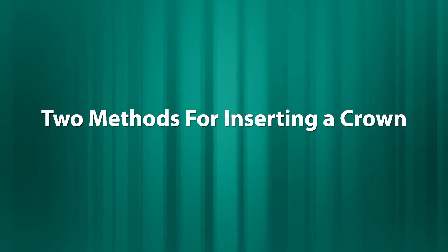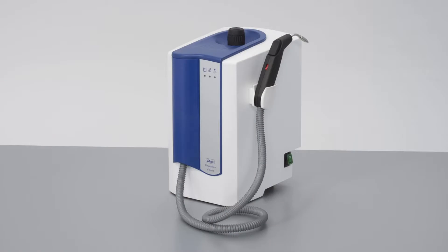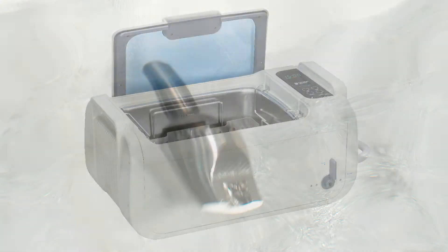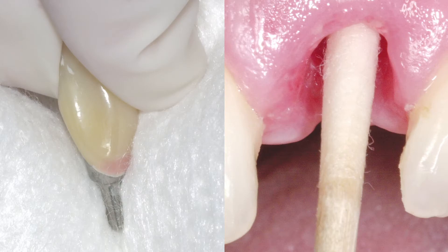There are two methods for inserting and seeding a crown. But prior to discussing these methods, we should always make sure the implant well is clean and free of any particles. Also, if the abutment is not taken directly from sterile packaging, it should be steam cleaned, ultrasonically cleaned, or wiped clean with alcohol to remove any contaminants prior to its insertion into the well of an implant.